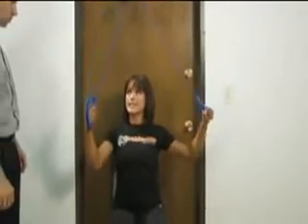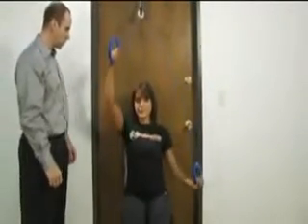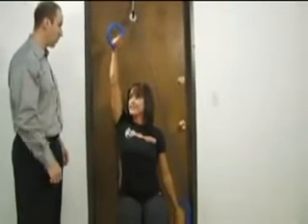Requires a lot more stabilization. Okay, so a little bit more stabilization. It has a feel at the top of the motion as well. A lot more stretch going on. So you get more stretch. Okay, now we're going to make it even harder still.